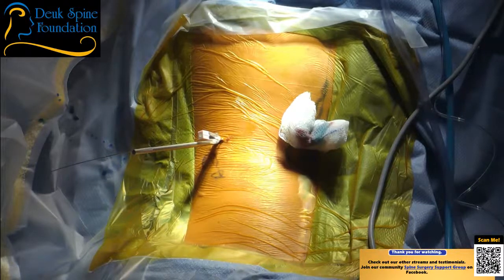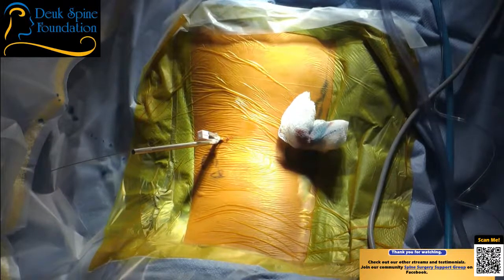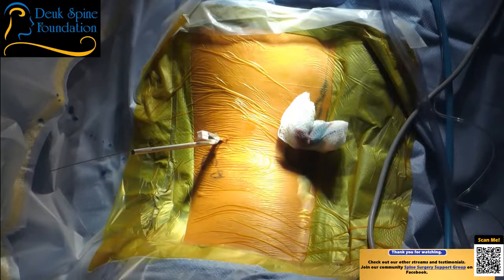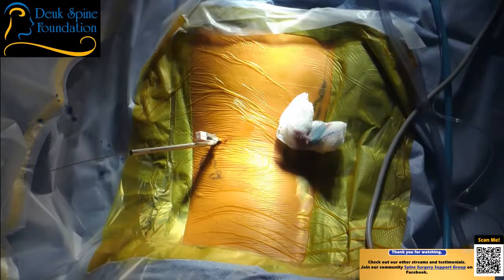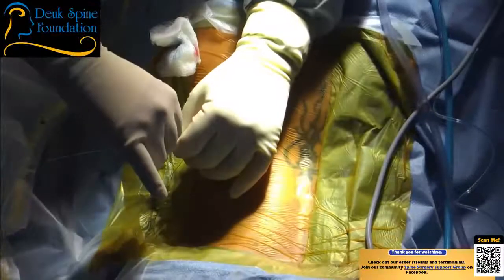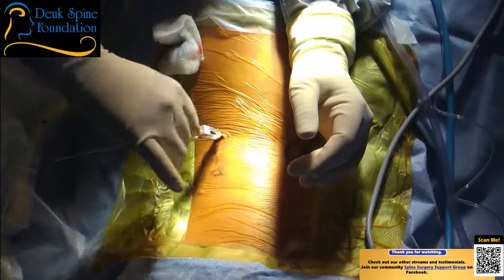All right, so what is the purpose of this surgery? The purpose of the surgery is to eliminate this patient's back pain and leg symptoms: leg pain, numbness in the leg, sciatica. So we're really treating back and leg symptoms, mostly pain, by repairing two herniated discs in her back without removing any bone from the spine. Almost all spine surgery is done by removing bone, but we're able to do it without removing bone because we're coming from the side.